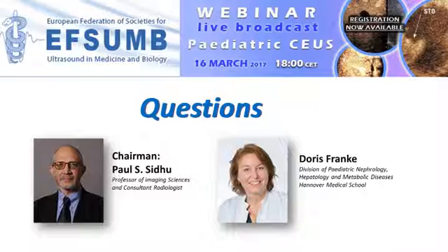And before you start the contrast, you will look with the B mode and the Doppler, and you will see how well perfused the lesion is, and this also influences your dosage. And for example, a spleen needs much less dosage than a liver. And all this comes together. So for me, I don't fancy these rules of thumb very much. So I really know my machine, and I do it from my gut, I must admit.